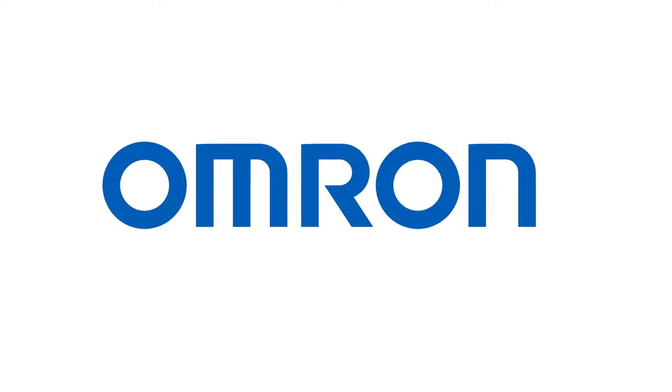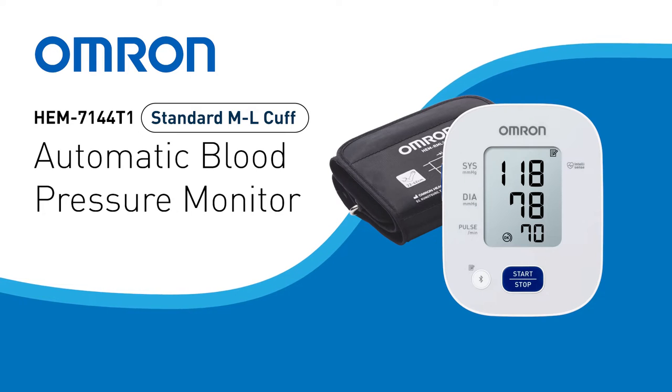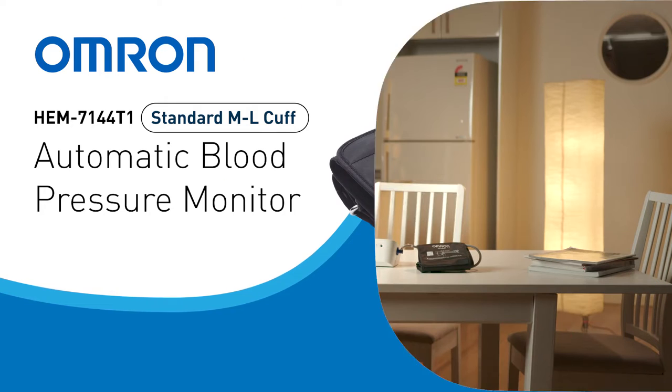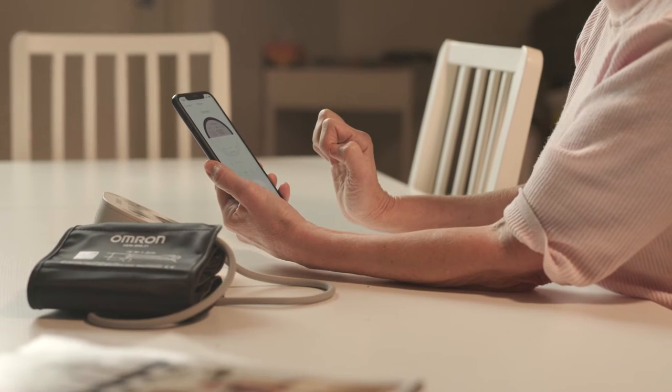Simple one-touch operation and irregular heartbeat detection allows for an easy-to-use blood pressure monitor equipped with additional memory and wide-range cuff. The OMRON HEM7144T1 standard blood pressure monitor comes with Bluetooth connectivity.